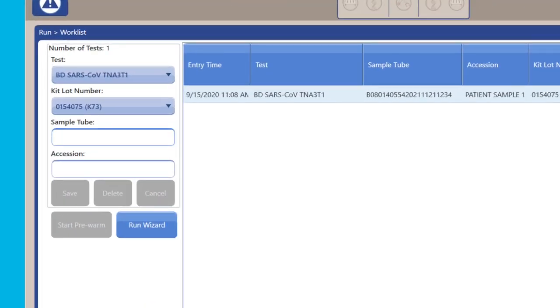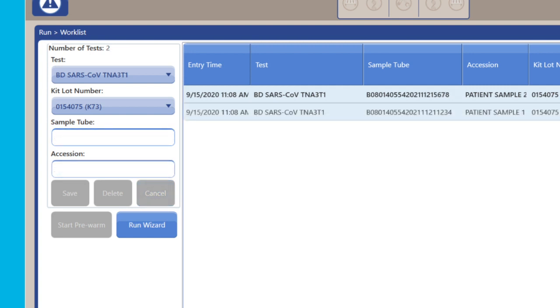For all remaining sample buffer tubes, repeat selection of the UDP, entering of sample buffer tube information into the work list, and selecting the appropriate kit lot number.